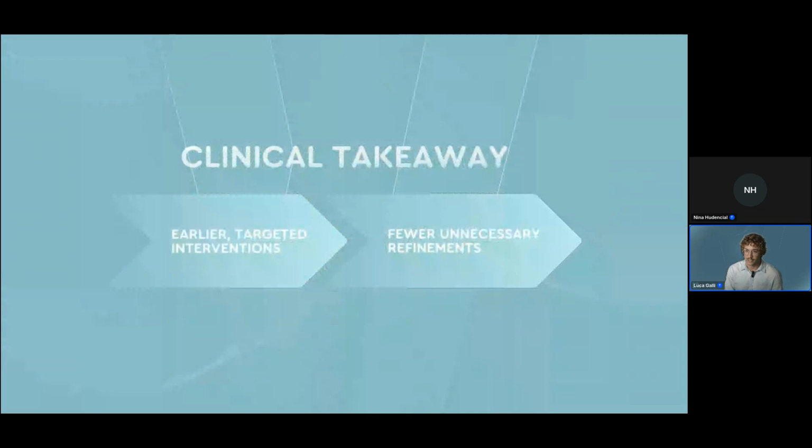The clinical value here is massive, in my opinion, because we can intervene early. I mean, we don't have to wait 2 months of watching teeth fail to move. This makes everything easier to predict during treatment and reduces the need for endless refinements.